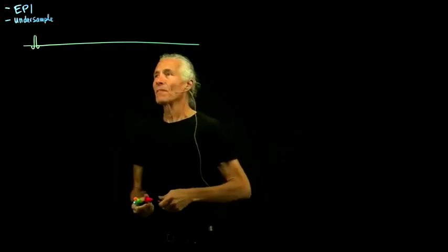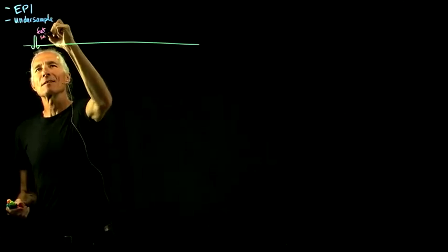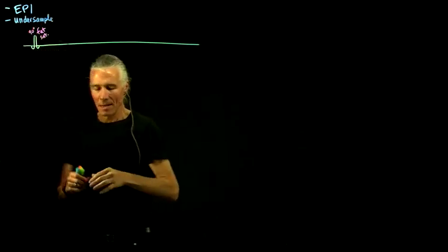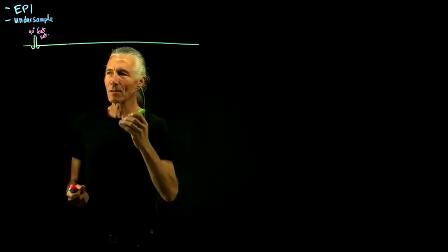And so for that reason, we do a fat saturation pulse. This is a 90-degree pulse, and the idea is we tip all the magnetization to transverse so there's no longitudinal.